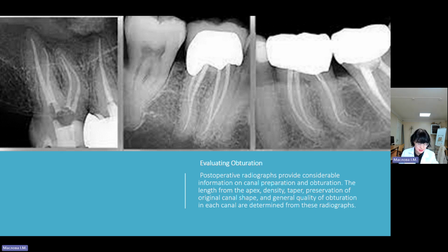To identify lesions, the radiograph must be studied carefully by someone with a working knowledge of the changes that indicate pulpal, periapical, periodontal, and other bony lesions. Many changes are obvious, but some are subtle.